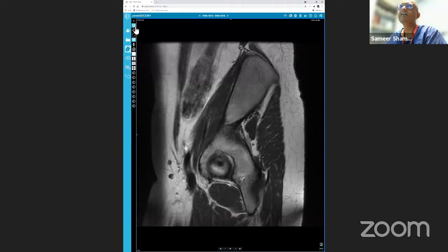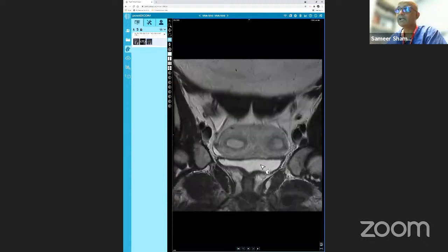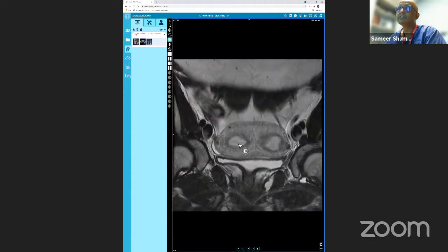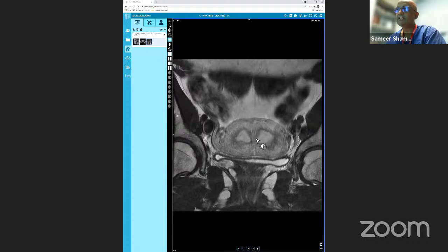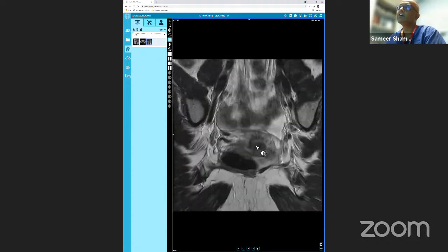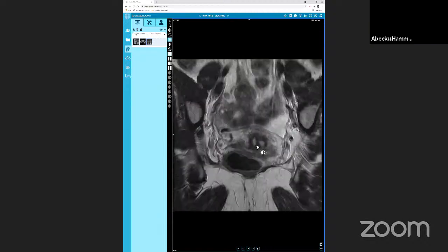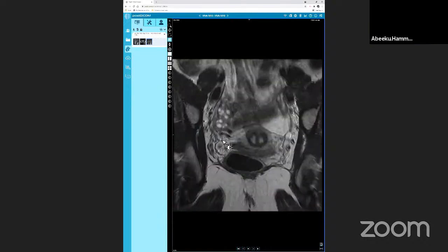It was tricky, because you probably wouldn't have seen many gynae MR, but you were right in going through saying that there are two endometrial cavities which extend all the way to the cervix and also the vagina. So you got two everywhere. When you have two everywhere, it's uterus didelphys. And then you got confused with this.